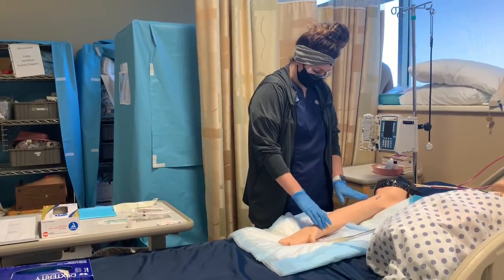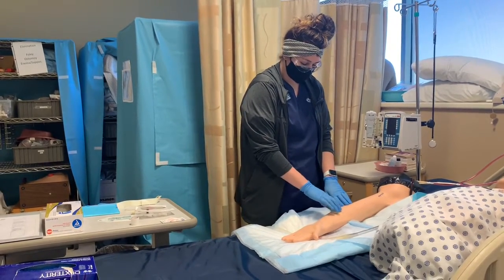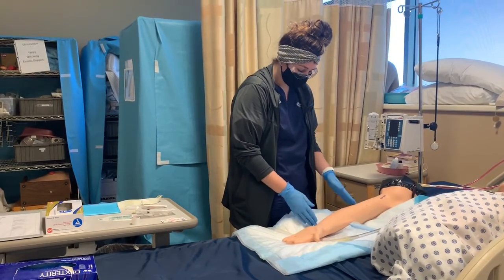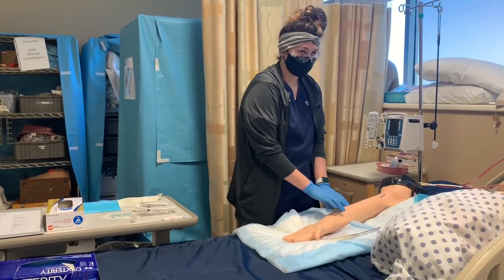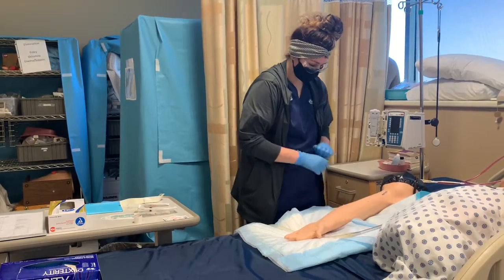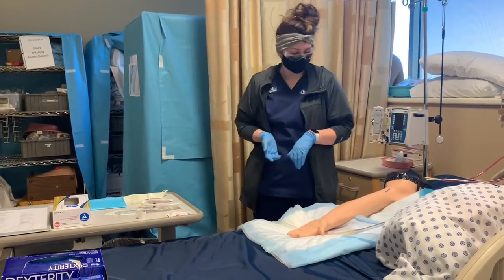Okay, so the arm looks good. I'm feeling for some good veins. I want to avoid the joints and be as distal to those as possible. I want to find a good, long, and straight one. Okay, I feel like I got a good one there. Okay, so she understands. I can gather my supplies.